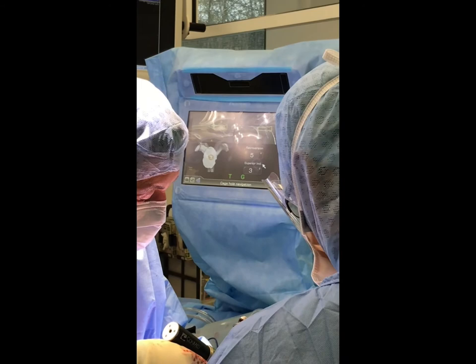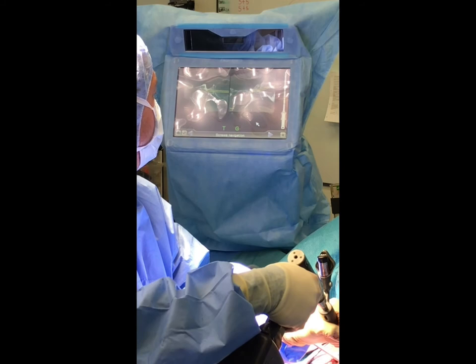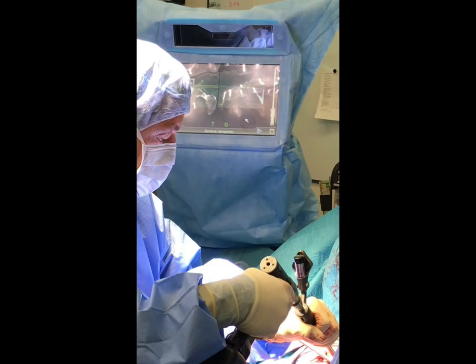This is probably the most useful part of the navigation because we're using it to give us real-time information on exactly where we're drilling into the bone as we go, and we can make adjustments to get maximum screw length for fixation of the glenoid.